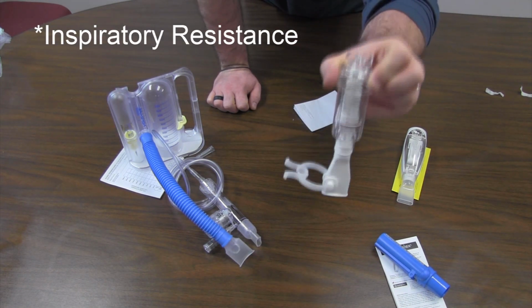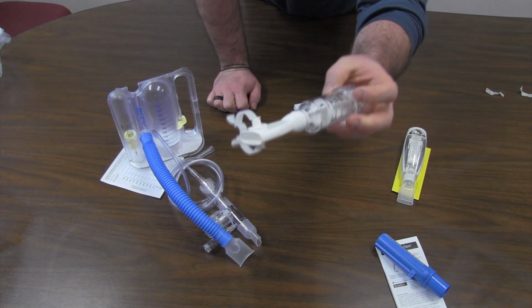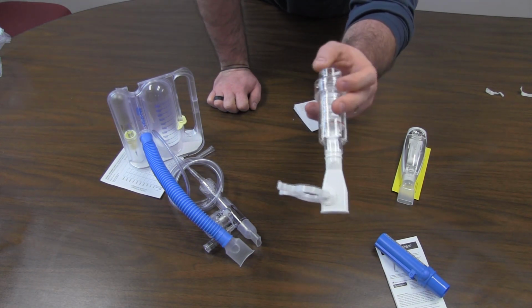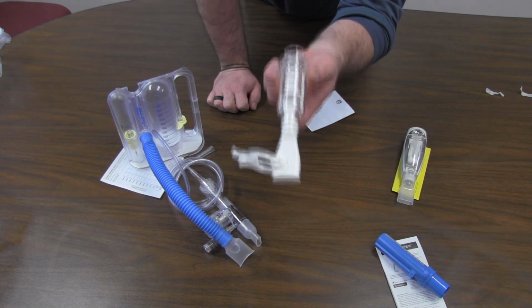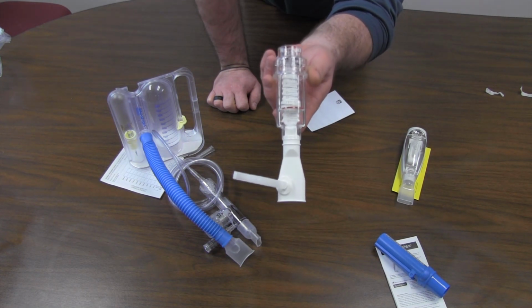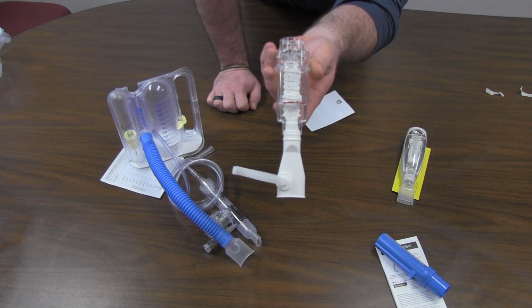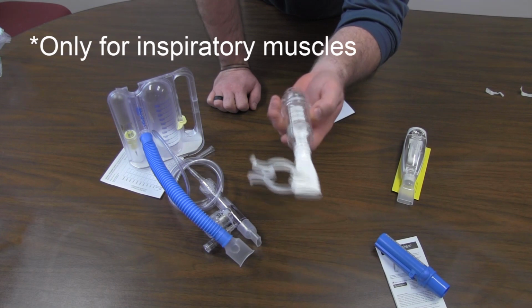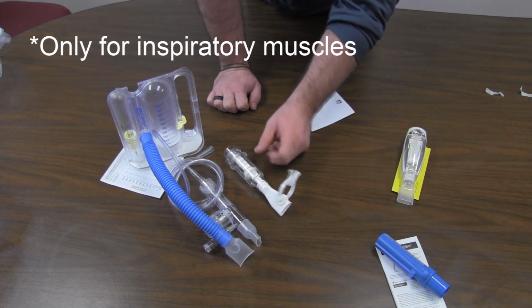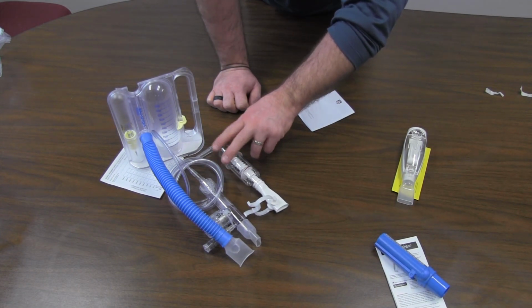This will also help them mobilize secretions, and it's going to build muscles. It could also be called a respiratory muscle trainer, and it can be done by blowing into it or also sucking on it and actually checking your inspiratory muscles. So I'll show you that in a little bit too. We're going to put that over here more on the side of lung recruitment.